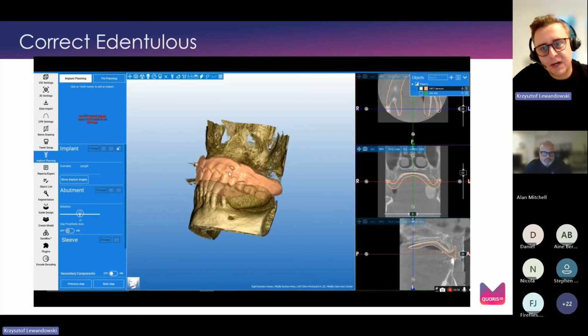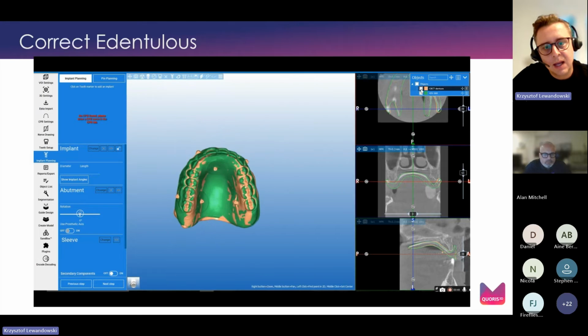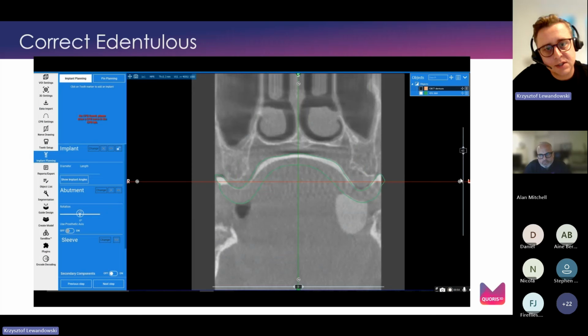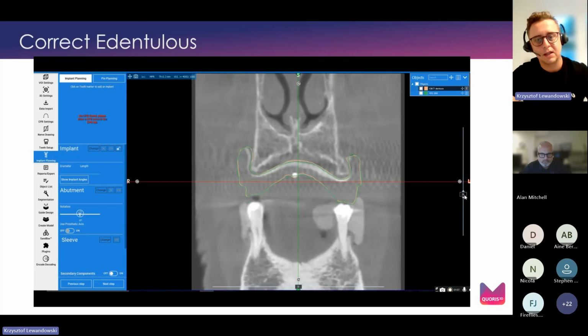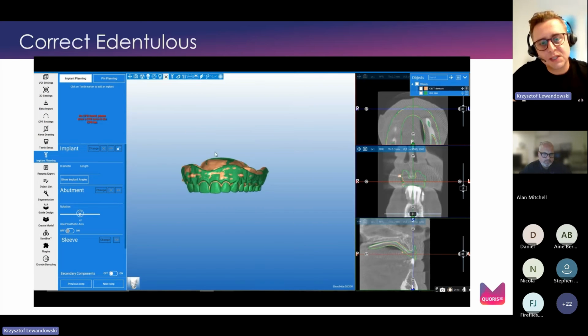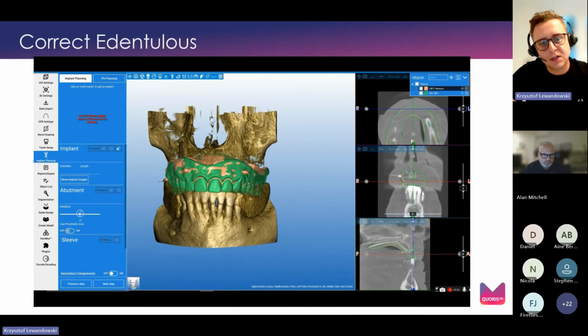In addition, the doctor also provides us a 360 IOS of the denture, and after assessment of the quality of the occlusal surfaces, we decided to actually use this 360 scan for designing our pin guide. So what we've done, we've stitched together the 360 IOS scan of the denture together with the scan of the denture alone CBCT record.